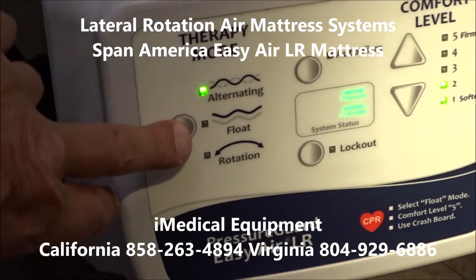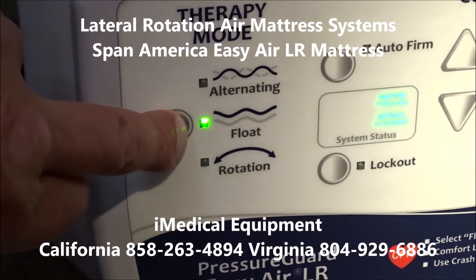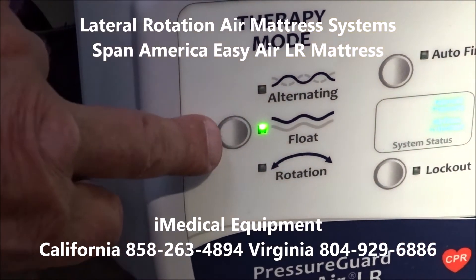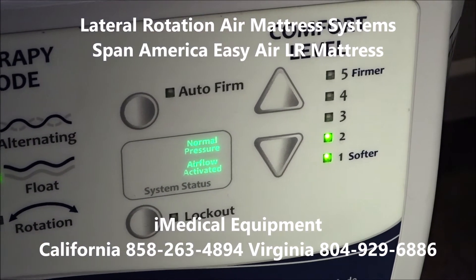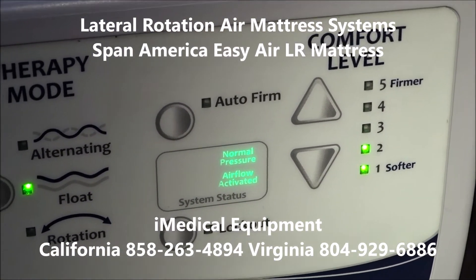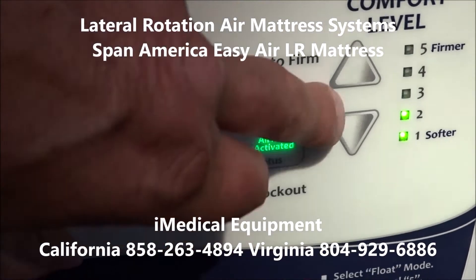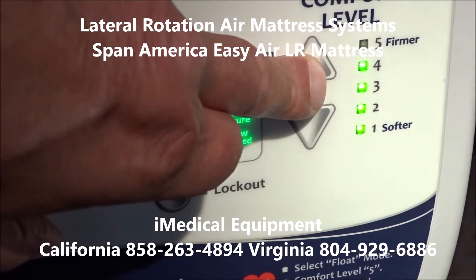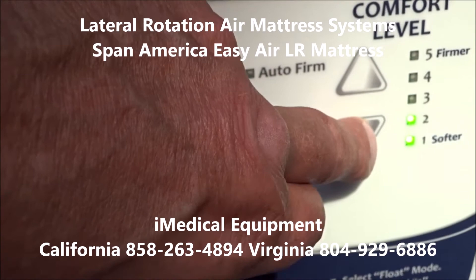You've got multiple different modes: alternating, rotation, and float. Rotation is the lateral rotation that'll help turn the person throughout the night. You also have an auto firmness — the mattress will sense the firmness and adjust, or you can let the patient determine what's best for them and adjust the firmness manually, which is a feature a lot of patients really enjoy.